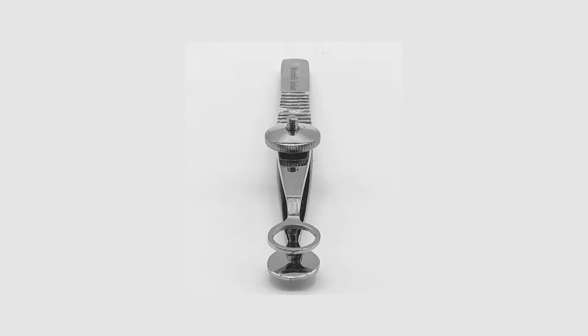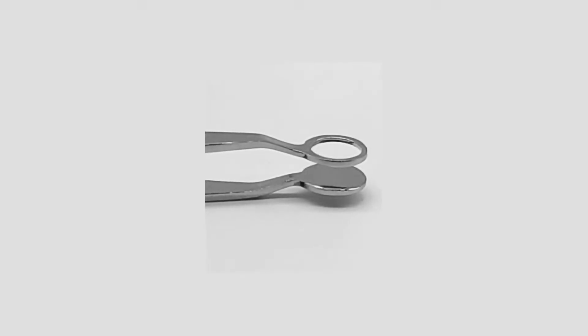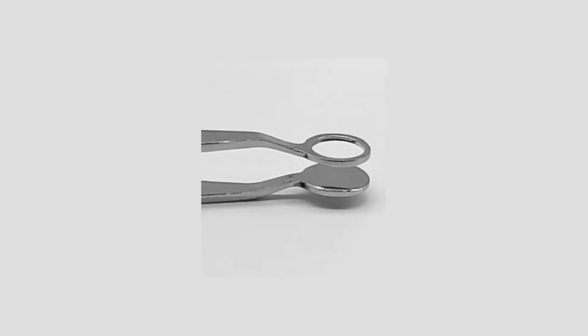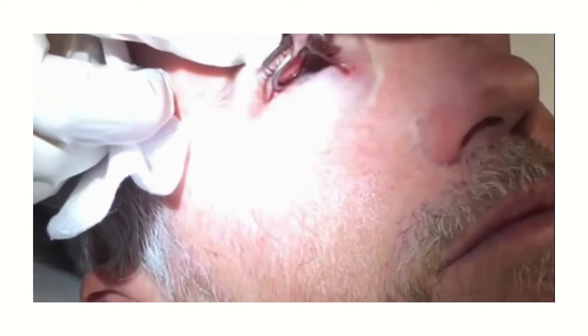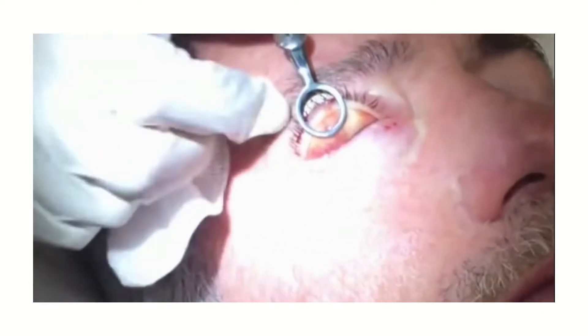The chalazion clamp is similar to a pair of forceps. One extension has a flat, solid, oval plate; the other, a ring-like structure that is used to clamp and retract soft tissues.